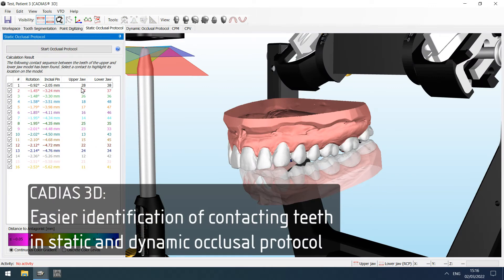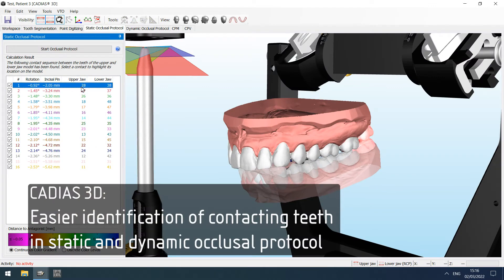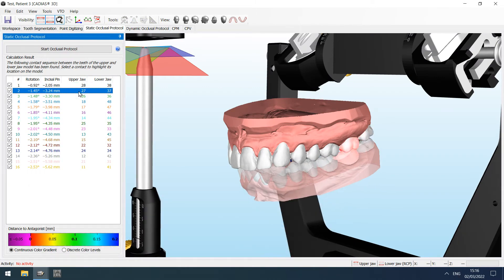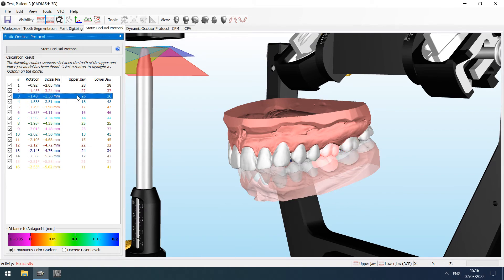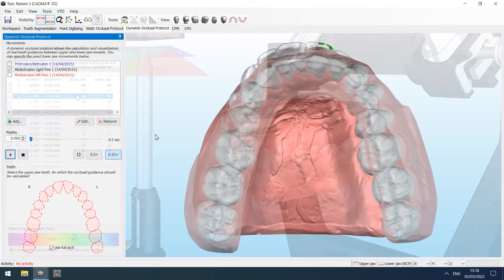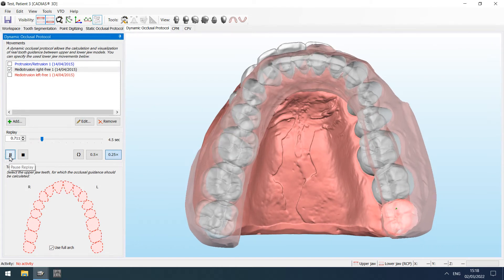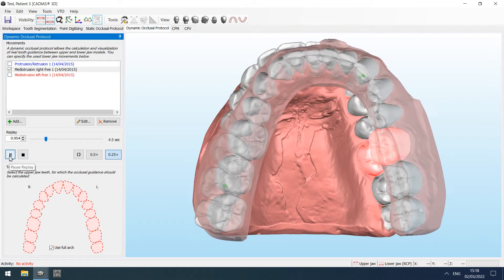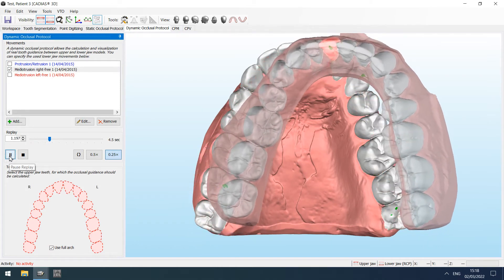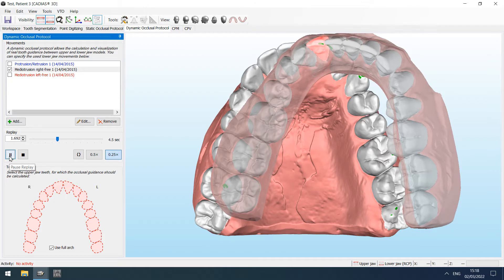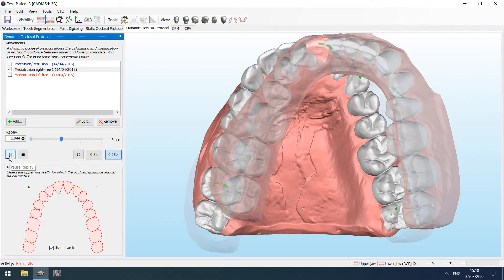In the static occlusal protocol, upper and lower jaw teeth coming into contact will now be highlighted in red color. The same applies for the dynamic occlusal protocol, making it easier to identify the teeth with guiding function throughout the movement.